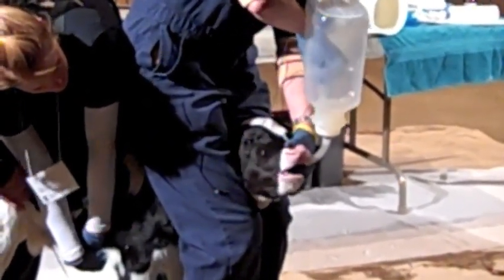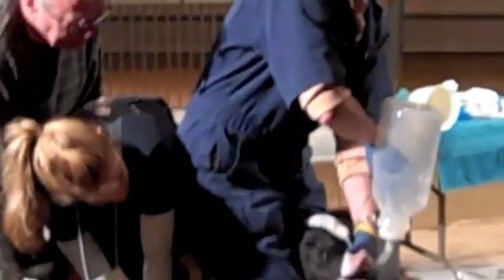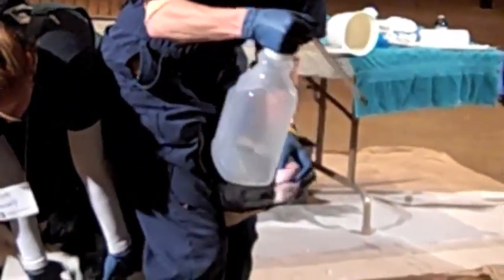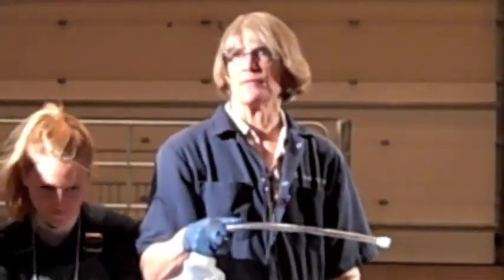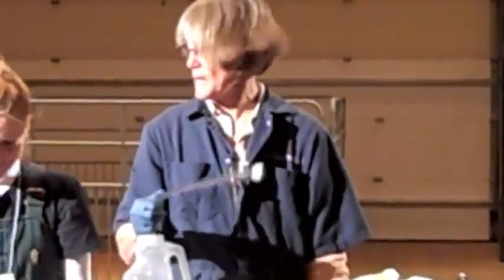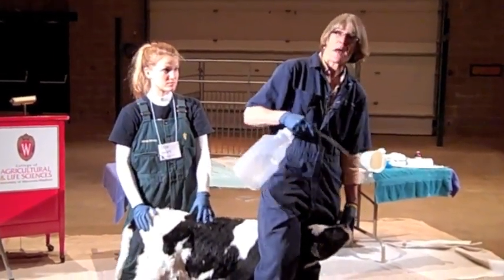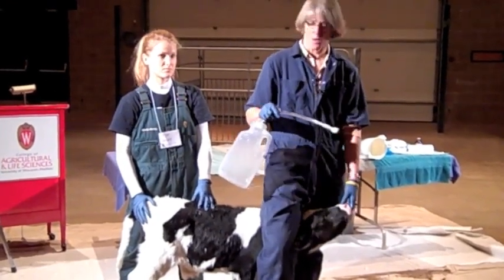A lot of calves benefit from electrolyte solutions. This electrolyte solution, like many, says on the label it goes well in milk or milk replacer — but most of the time when we're feeding calves with diarrhea electrolytes, it's the water they need more than the electrolytes. So make sure, even though it's compatible with milk or milk replacer, what that calf needs is volume. Esophageal feeders: right size for whatever you're giving. No trauma. Put your patient people on the esophageal feeder portion of the tools.